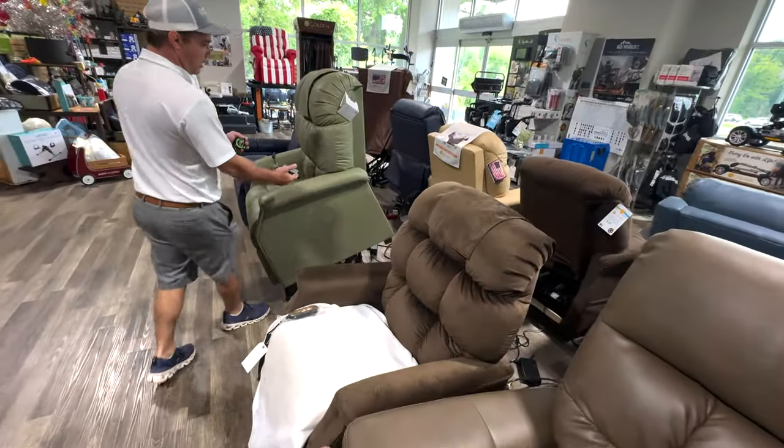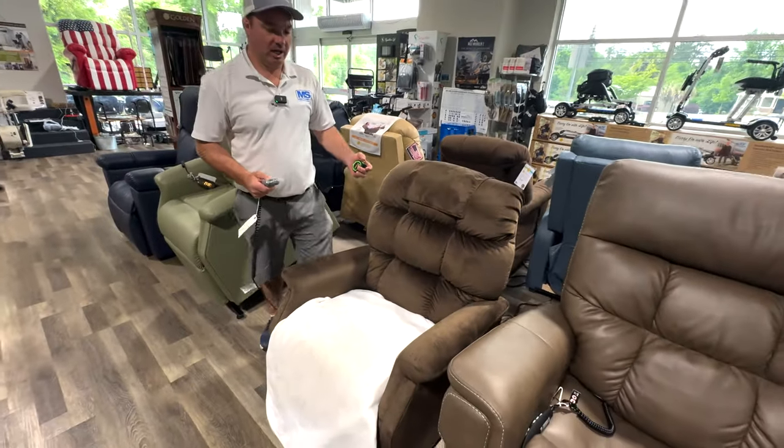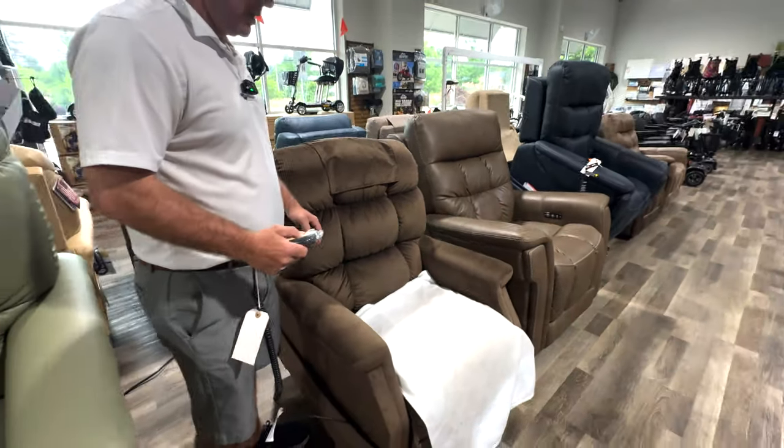Standard lift chairs all tilt this way, but sometimes people want a vertical uplift instead, and that's what this chair can do.